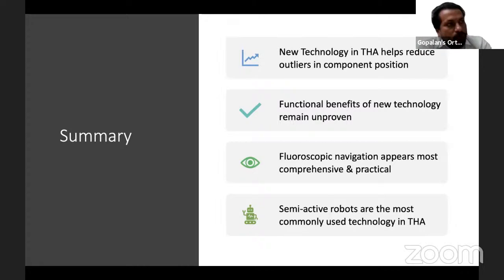And do you think there's a role for technologies like artificial intelligence for hip replacement? Because there has been some interest in identifying, when we just talk about new technology, suppose you have a hip implanted somewhere, and he's coming for revision to you, and you get the X-ray and put it onto some artificial intelligence-enabled software, and you get what is the implant.